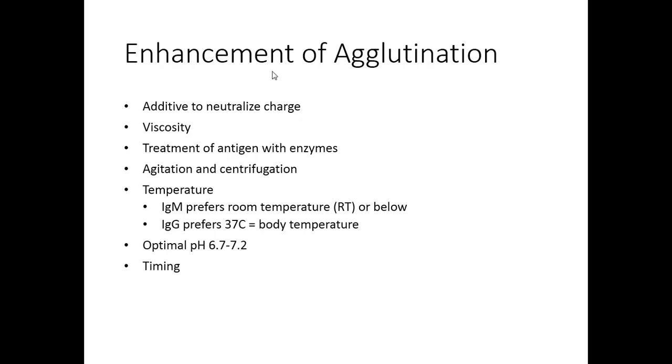Sometimes we can use enzymatic treatment. We can treat the antigen with some enzymes, also eliminating some of that charge difference.